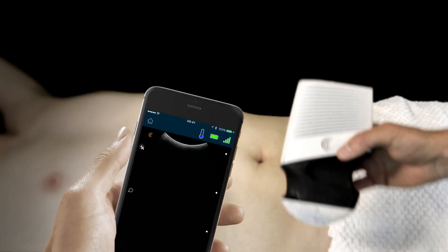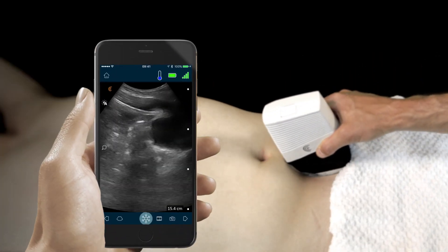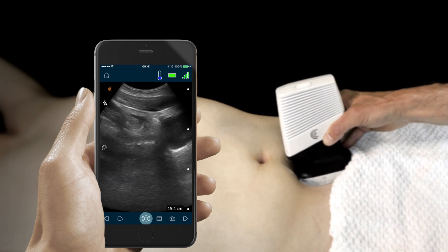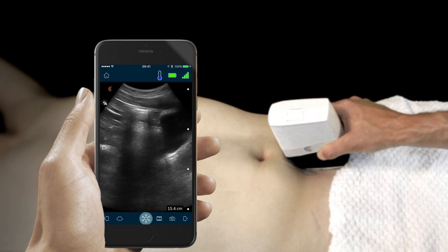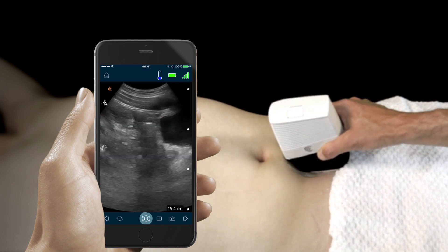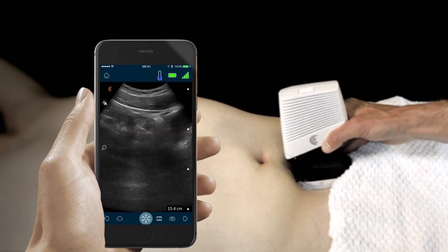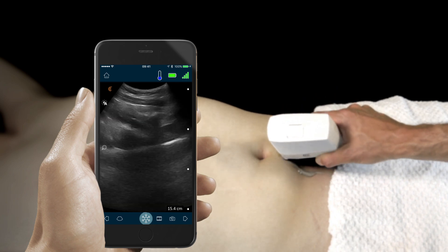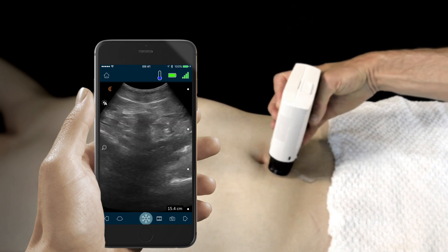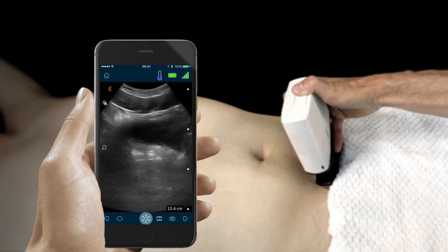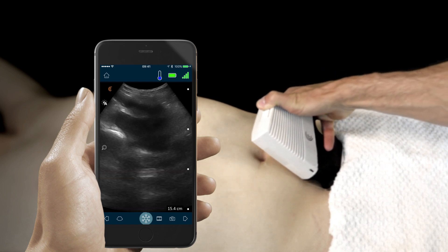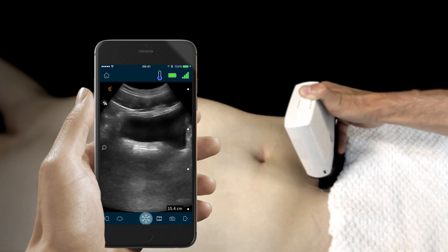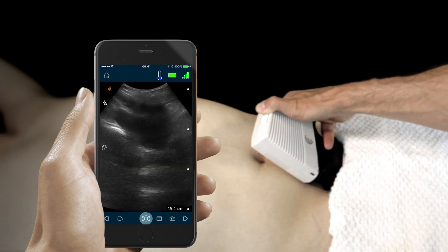For the final phase of the FAST examination, we're going to examine the pelvis, looking for any sign of free fluid between the bladder and the rectum. We'll fan in the long axis to the patient's left and right to make sure that we don't miss any small, subtle collections of fluid. We'll then switch to a short axis, again fanning caudally and rostrally to ensure we don't miss any small collections of fluid.